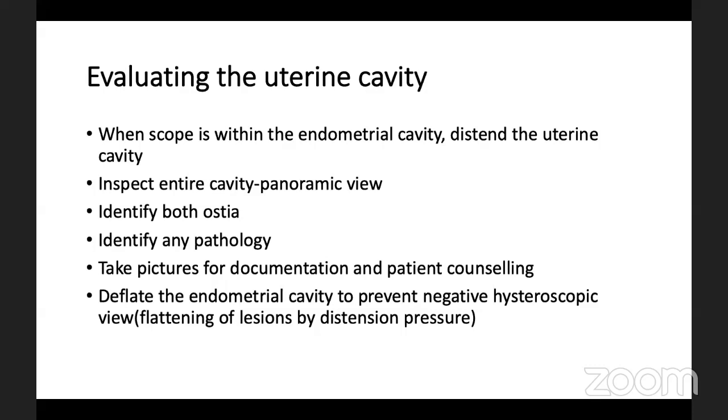So take pictures for documentation, and you can also always refer to these pictures later on where you can compare with other previous pictures, and you can also use the same pictures for patient counseling. I find that in my office, I have a normal looking hysteroscopy picture. So I use that as the baseline to explain to the patient, and then I show them how different it is from whatever findings we've found for that particular patient. It helps as well when you're counseling the patient, so that they actually have a visual impression of what the pathology is like, what the polyp looks like, what the fibroid looks like, where it is, so they appreciate it more.